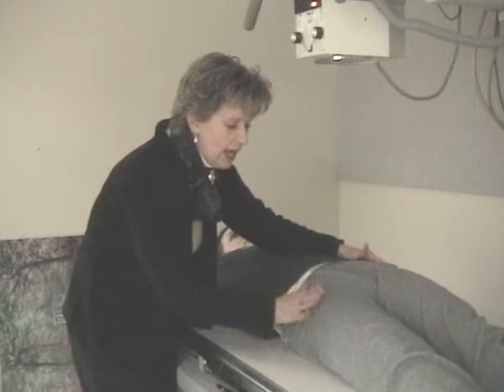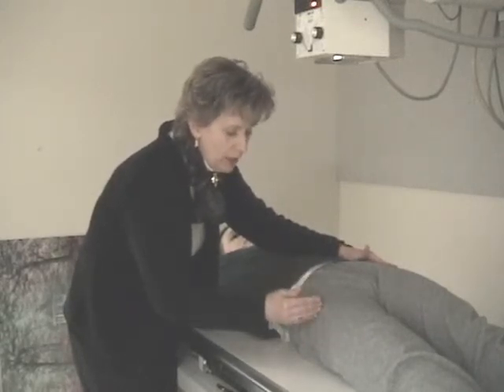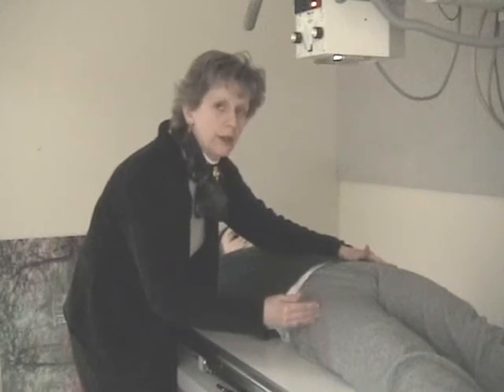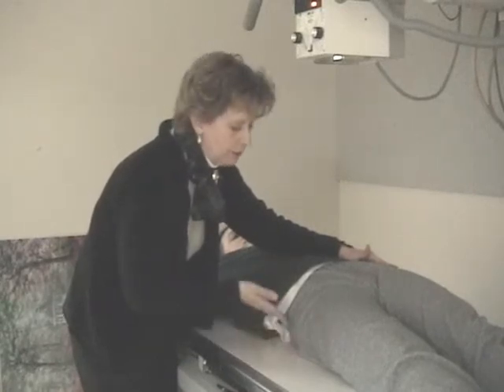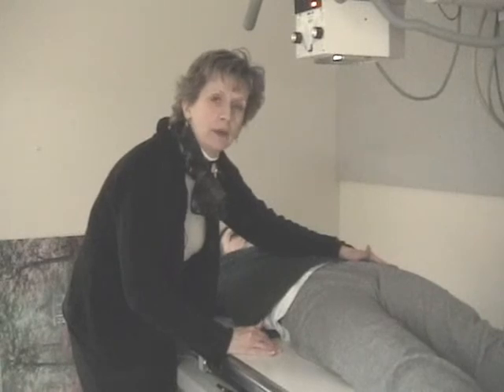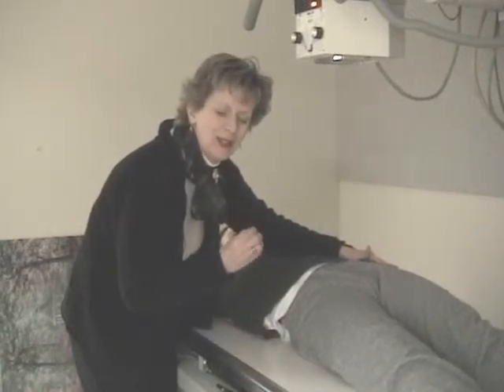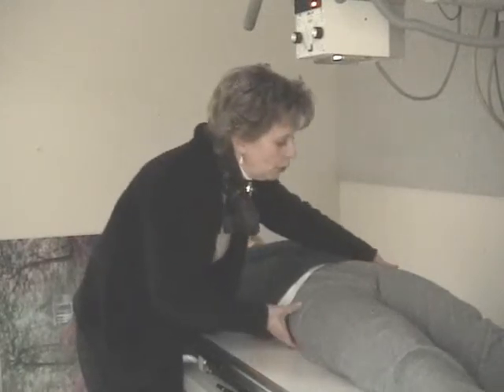On the same side of the patient, if this wing is wider, this obturator foramen will be smaller. On a radiographic image, you look for those landmarks to determine if there was rotation or not. The wing that is wider is the downside, or the obturator foramen that appears smaller is the downside, or vice versa. No rotation evident.